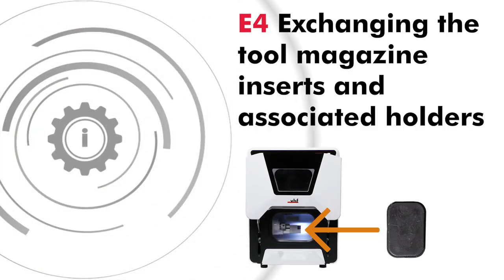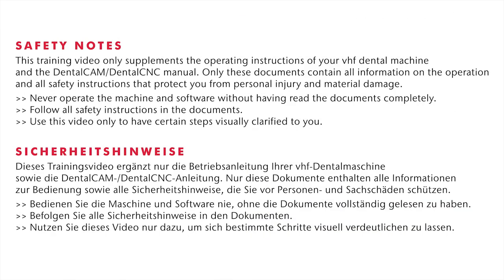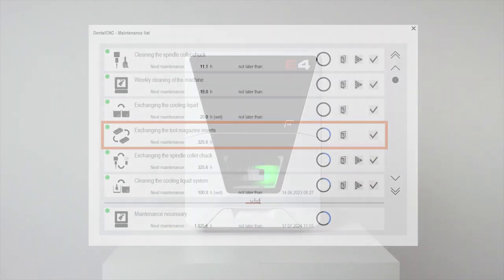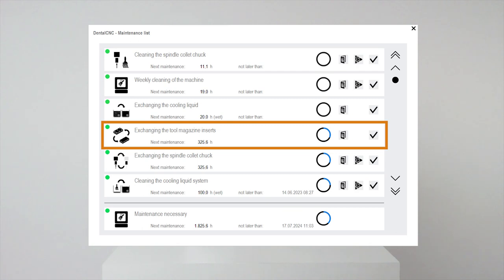While the tool magazine inserts need to be exchanged regularly, the tool magazine holders only need to be exchanged if they are defective. You can find this maintenance task listed as exchanging the tool magazine inserts in the maintenance section of Dental CNC.